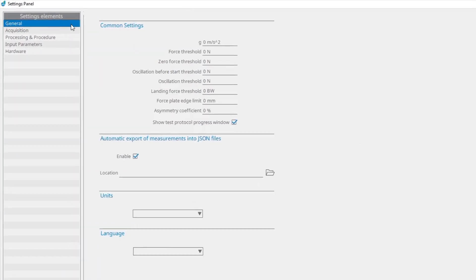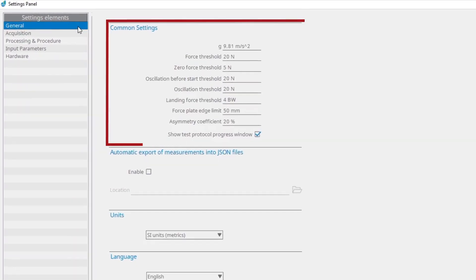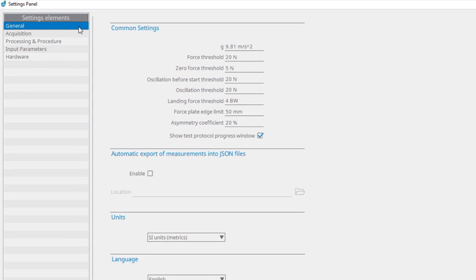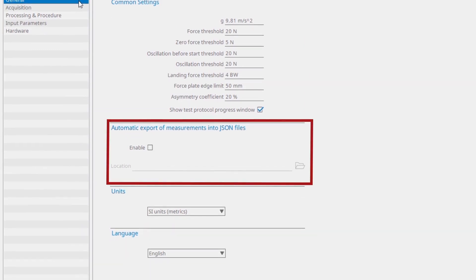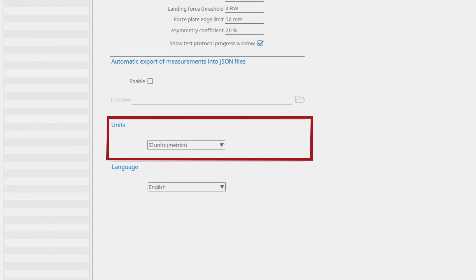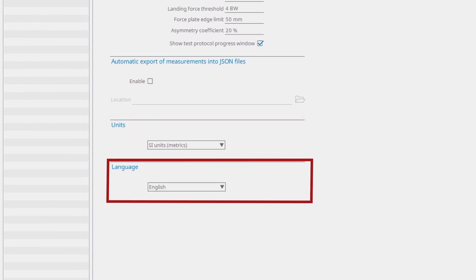Under common settings, you can change parameters that are used for all tests. For different purposes, this option lets you export every measurement made into a JSON file to the folder you specified. Here you can select between two types of units and various languages.